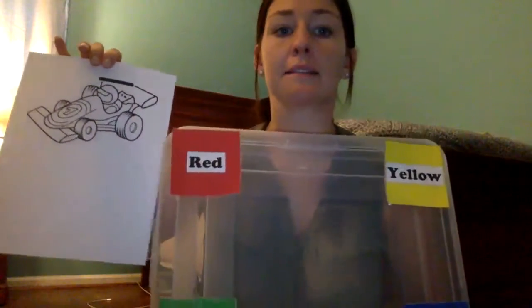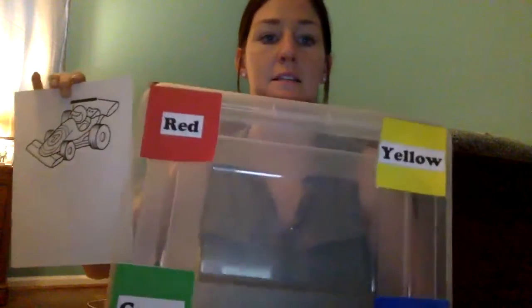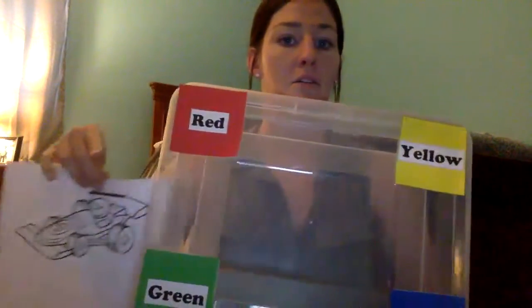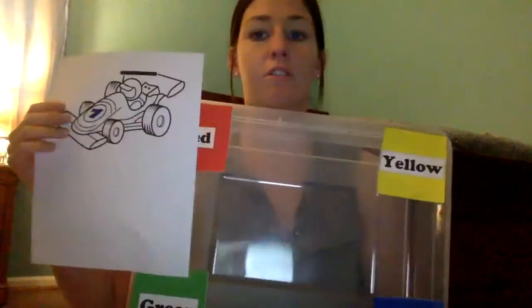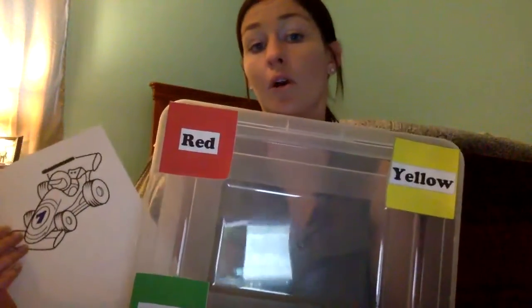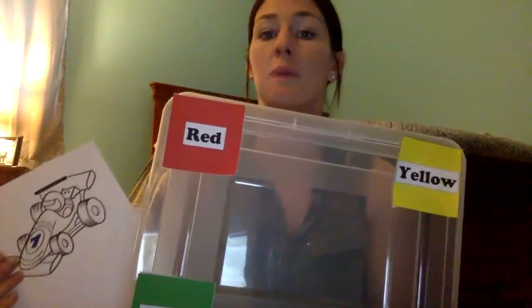So if he wanted to color a picture such as this, like a race car, I would ask him, what are we going to make the race car number? And then he could move his eyes and tell me the color. So let's say he said blue. So he could move his eyes and tell me that he wanted to color it blue. And the teacher would do so. So now the picture of the race car number is colored blue. This way he would be able to see his so-called artwork be brought to life and see himself as the artist by the colors he picked out.